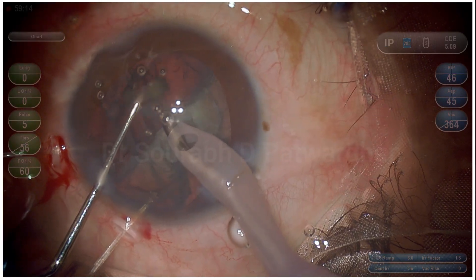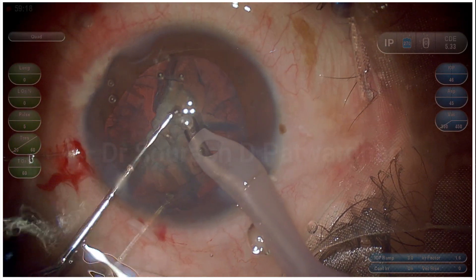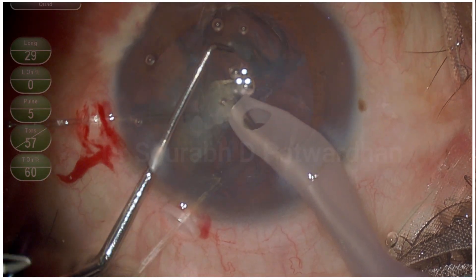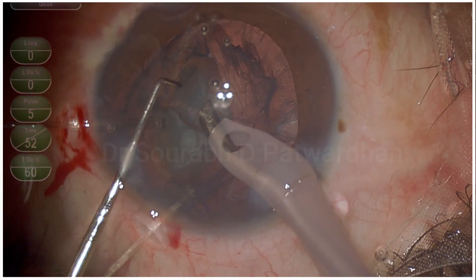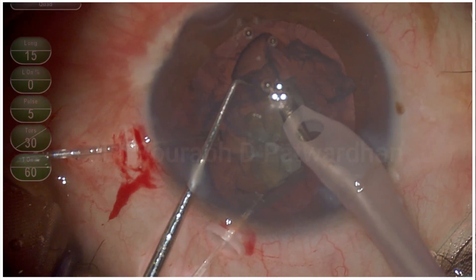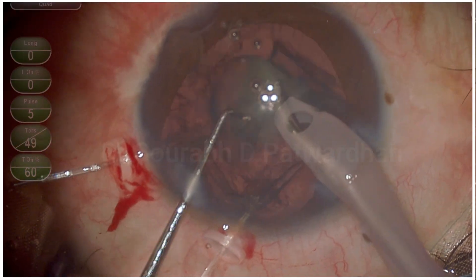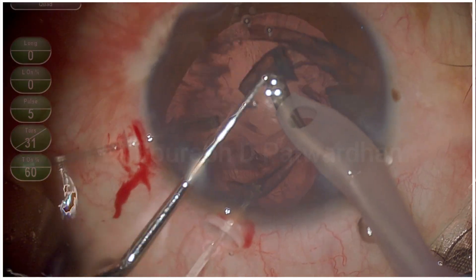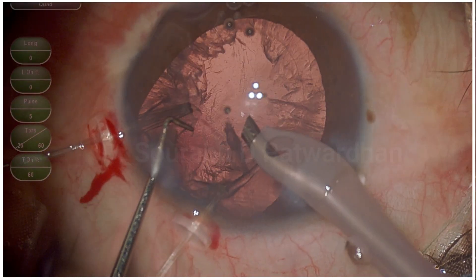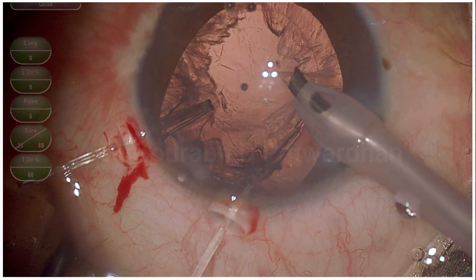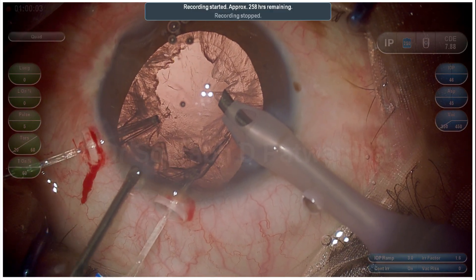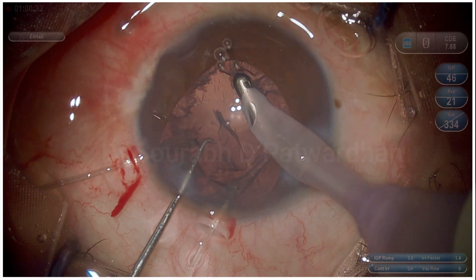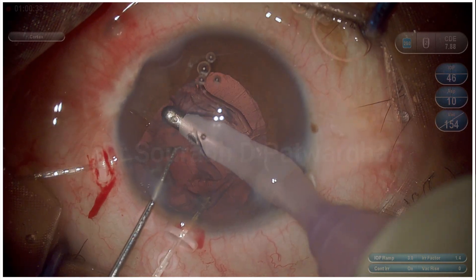As I go further, I reduce the vacuum a little bit for the last pieces, because in these cases, since the zonules are already damaged, there is a higher chance that fluid might pass through the zonules into the vitreous in the Berger space and start pushing the posterior capsule anteriorly. So at the end, when I go for the last piece, I generally reduce the vacuum by 20 to 30 percent. Here I am using Centurion phaco with Active Fluidics, so the anterior chamber maintenance is really good. But even with this machine, you need to make sure the posterior capsule is not bulging. That's why the importance of the microscope having good retro-illumination. Whenever I am going to take my phaco probe out, I inject methylcellulose or OVD so there is no prolapse of the bag, because whenever there is prolapse of the bag, the chances of vitreous prolapse increase.